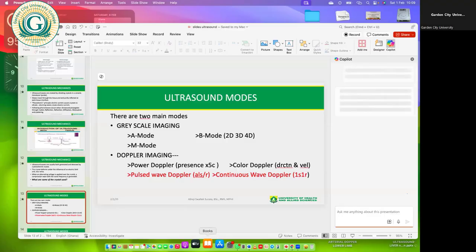In situations whereby you have twins, you may not be able to isolate the various cardiac activities of the babies when you are recording cardiac activity blindly. With ultrasound, you are able to visualize specific structures and then get the specific readings you want.